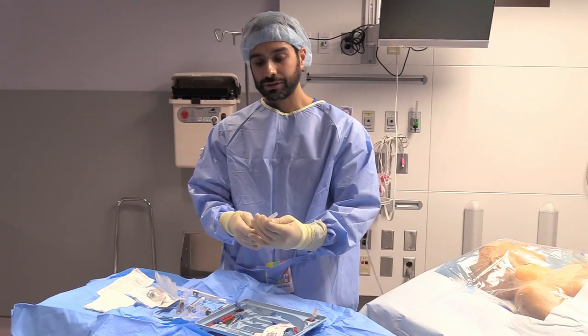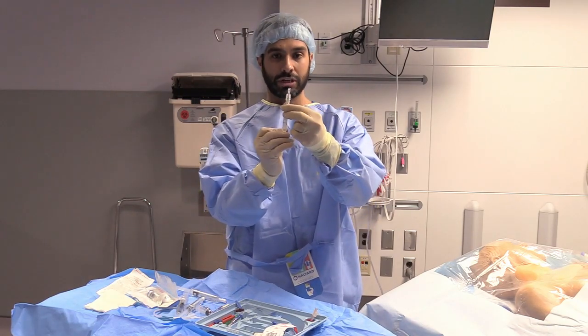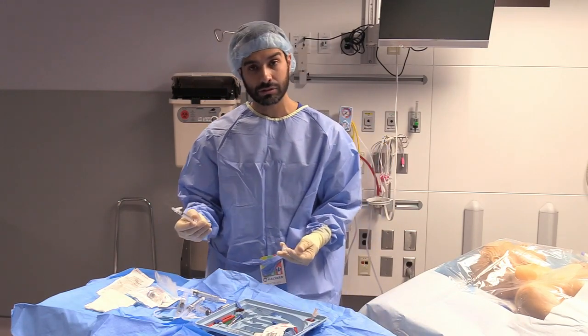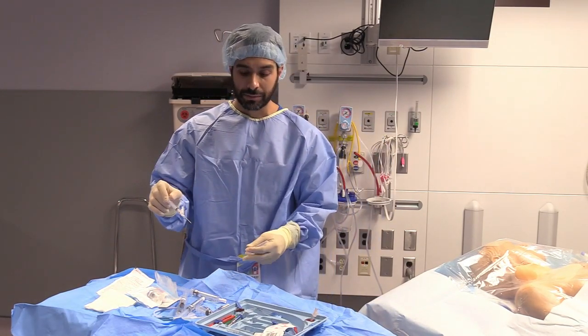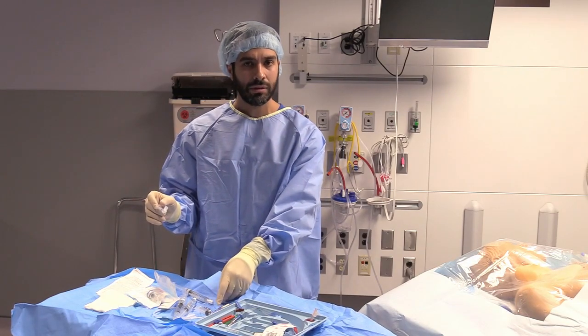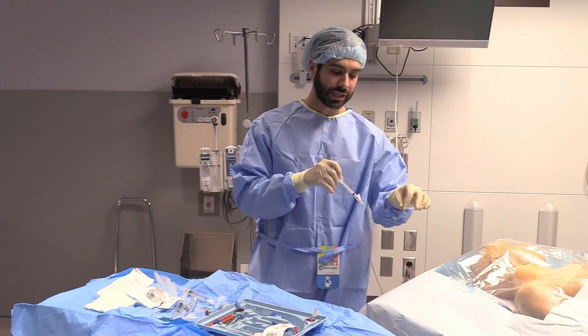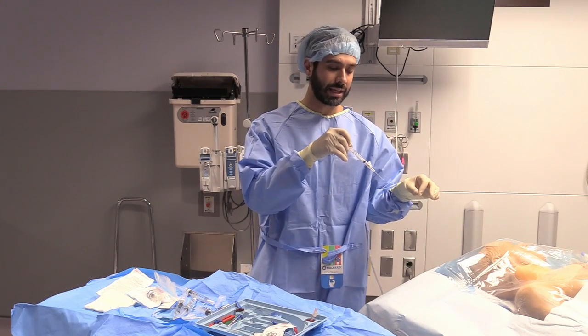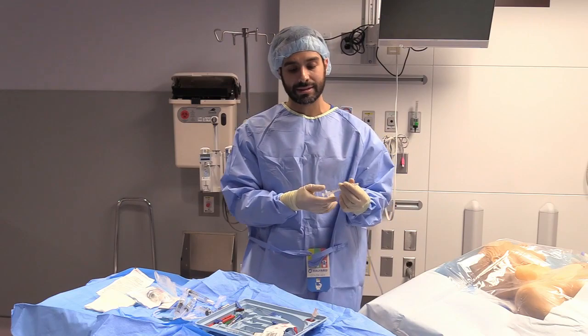Or much longer for somebody who may need a deeper injection and has a bigger neck. I also go deeper than just the skin, so some people just do a wheel. I like to go deeper depending, because when you're dilating it can be uncomfortable. So I would go deep, watching with my ultrasound as I go in. It's almost like a practice run to inject the lidocaine superficially in the skin and then deeper as I get closer to the vein itself.